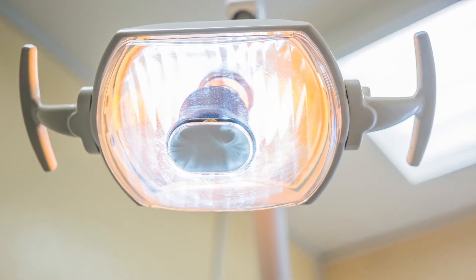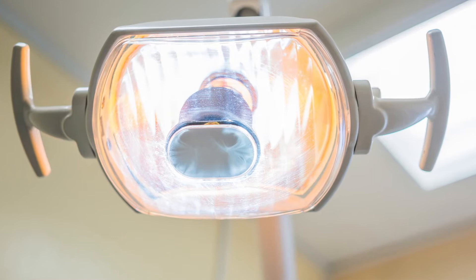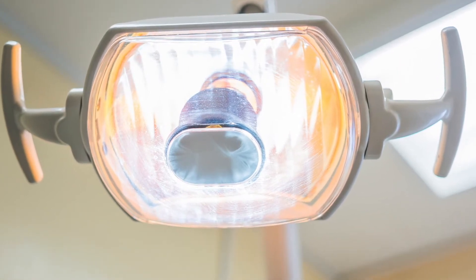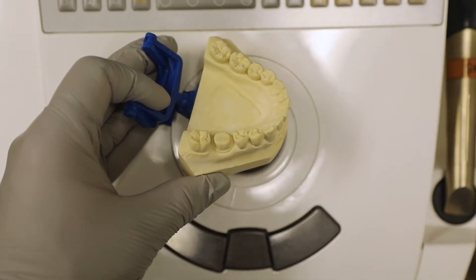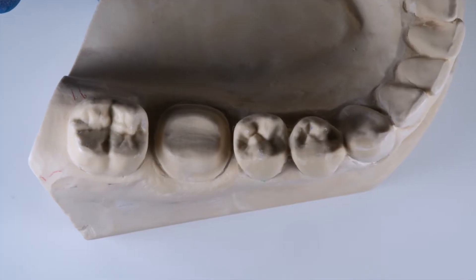If you are using an overhead light in your operatory, it's also not a bad idea to turn it away from the mouth while you are scanning, so the excess light does not flood the image and interfere with the camera's ability to see the teeth. Sometimes your camera may start to fog in the mouth, and it is a good idea to have your assistant blow some air onto the camera if this starts to happen.